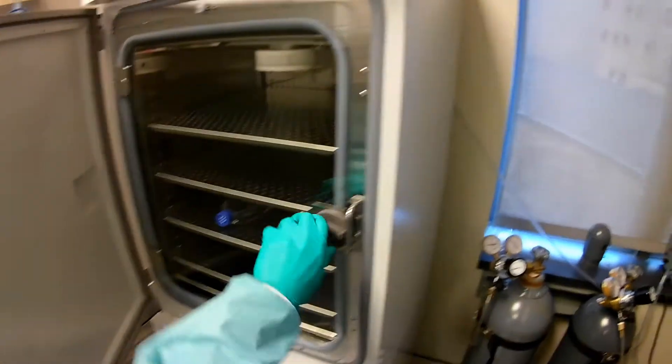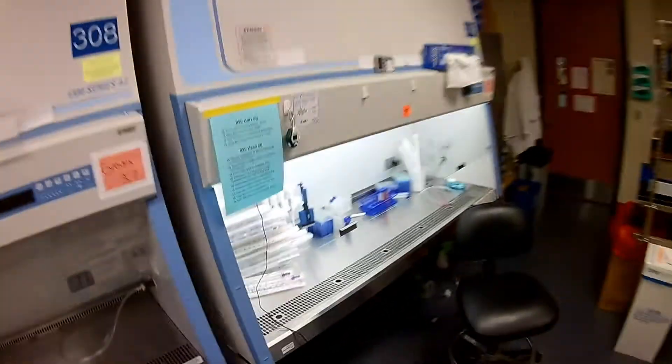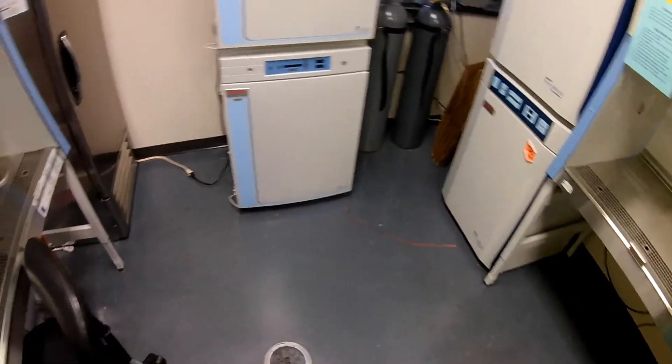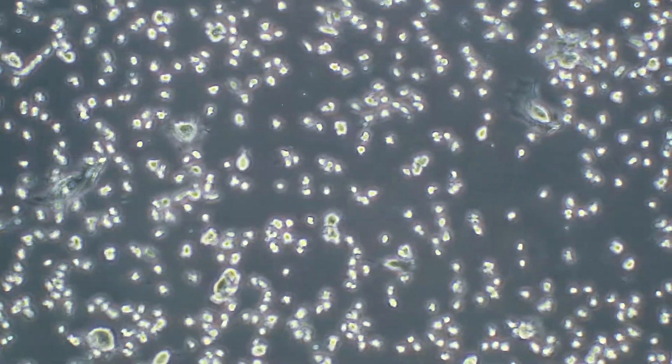We're at about 3:23. Let's go get it out now so I can show you what it looks like and decide if the cells are unattached. We're going to head over to the microscope to check it out. The cells are all rounded really well. There were a couple maybe still attached — we'll just give it a little tap with our hand. All the cells are pretty much detached and moving around. We're in good shape.